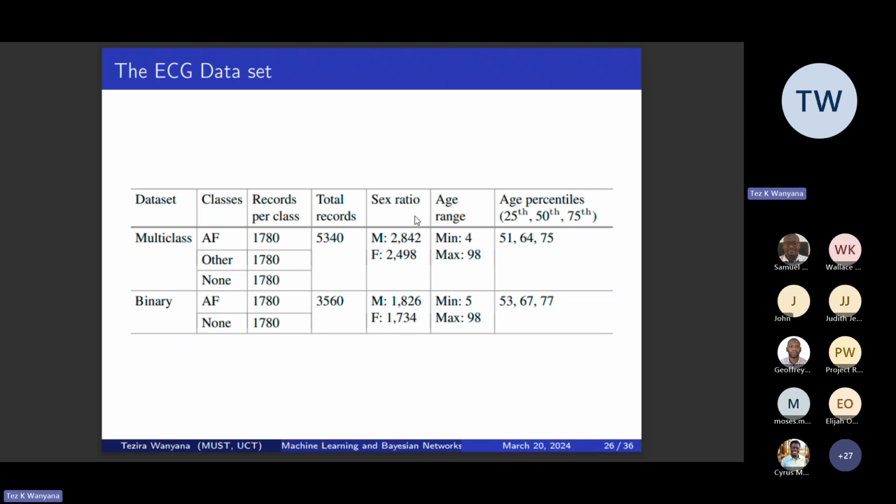That resulted in about 12 features, plus the other features that come from the statistical features, and then including age and sex. I think we ended up with about 150-something, maybe 160 features. So for our records, this is how the records look per class.